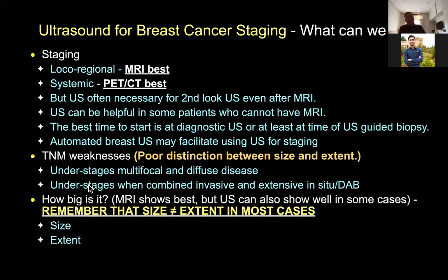And remember that size and extent are different. And I would encourage you to think always, in this case, is size the same as extent? If they're different, how do they differ? What is the extent? What is the size? Extent is going to represent the tumor burden much better than size. And if you want to guide treatment the best, you want to assess what tumor burden is, not just size.